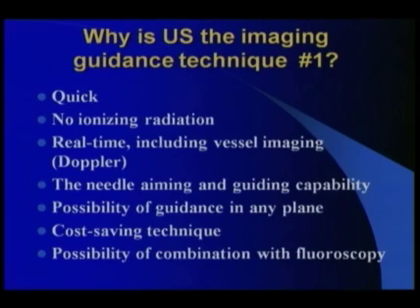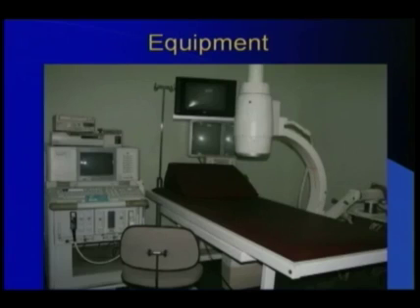We have the possibility to perform the procedure in any inline or oblique plane, which sometimes is very important. It's a cost-saving technique, and of course there is the possibility of combination with fluoroscopy. Because of these big advantages, ultrasound is very useful.